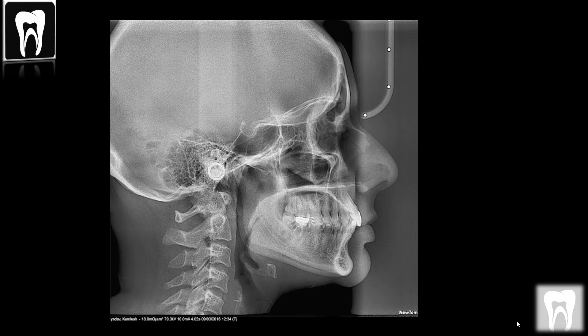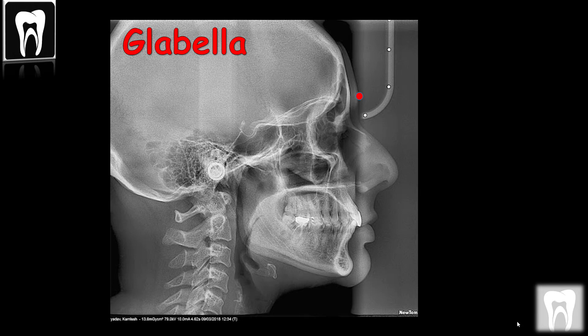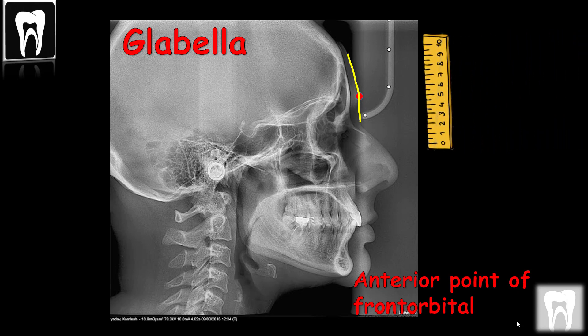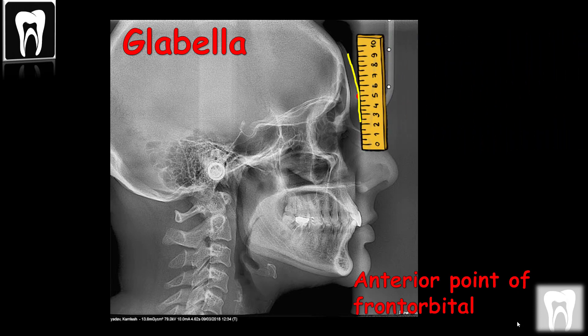Let's start with the glabella. The glabella is the most anterior midpoint on the frontal orbital soft tissue contour. To find the most anterior point, bring a ruler parallel to the front edge of the radiograph from the right side of the image to the left side to make contact with the first point of the soft tissue. This contact point is our glabella.